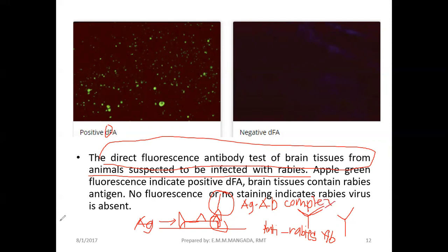So guys, in the fluorescent assay, they're actually using fluorochromes to label these antibodies, para ma-visualize natin kung may binding na nangyari, kasi nagkakaroon tayo ng binding kapag present yung antigen sa tissue. But if, for example, dito sa negative natin, meron tayong tissue na wala nung rabies antigen, kahit mag-add ka ngayon nung antibody mo, wala siyang pagbabindan. So your antibodies will be unbound.